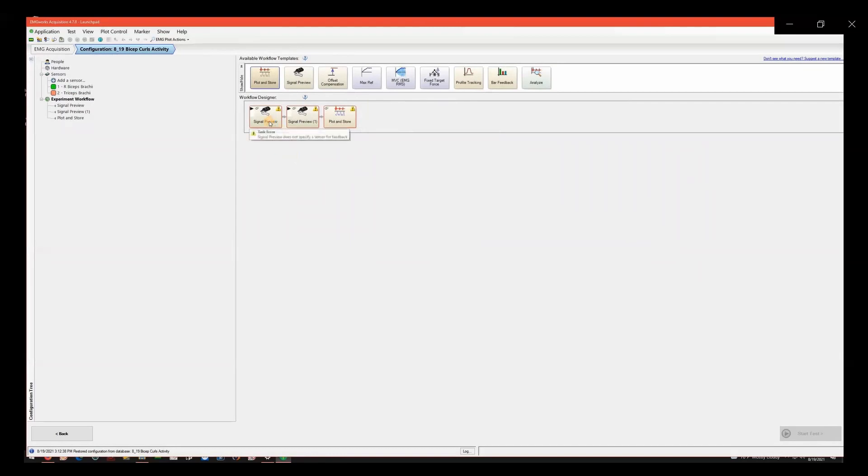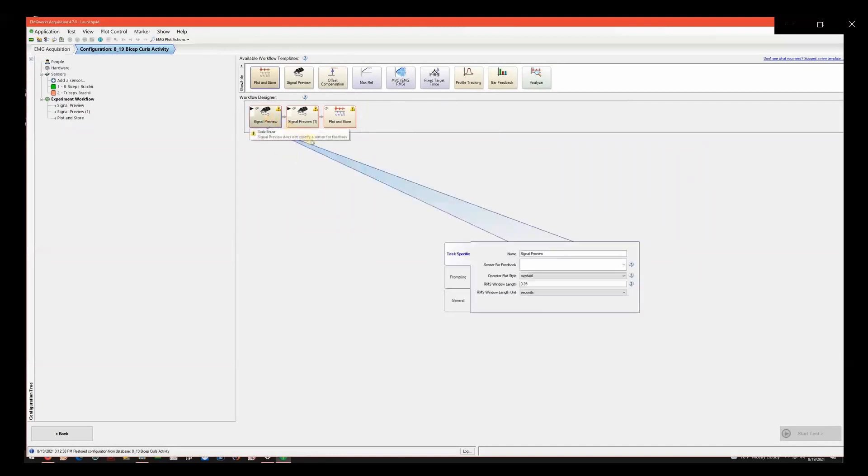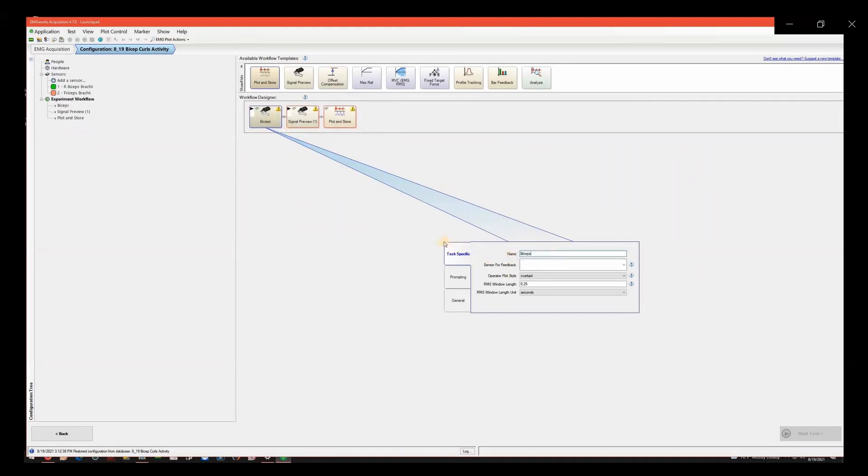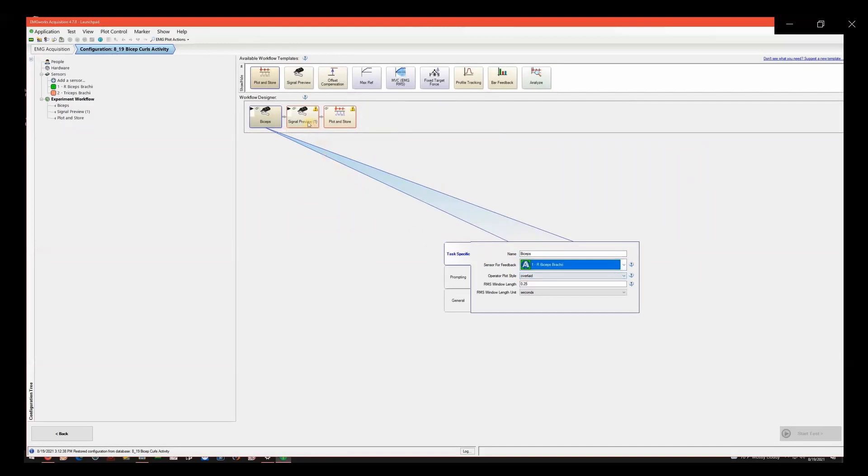The Signal Preview shows a real-time data feed of sensor activity without saving any of the data. This allows for verification that sensors are placed in the correct spot on the body and are working properly. Change the name based on the sensor you will be checking. Select Sensor for Feedback.